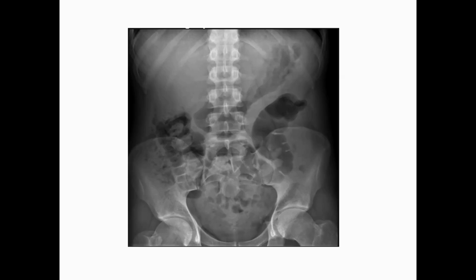Also if you suspect colitis, to see any signs of toxic megacolon, and also for foreign bodies and tubes. So these are the indications of the abdominal X-ray.